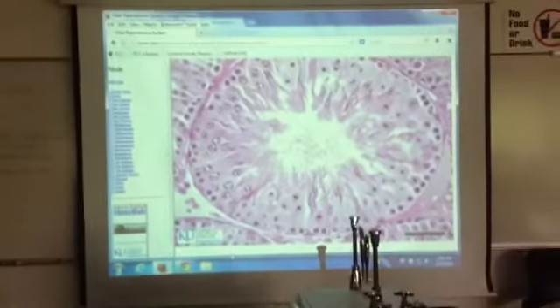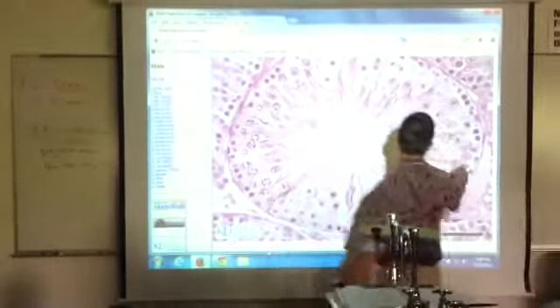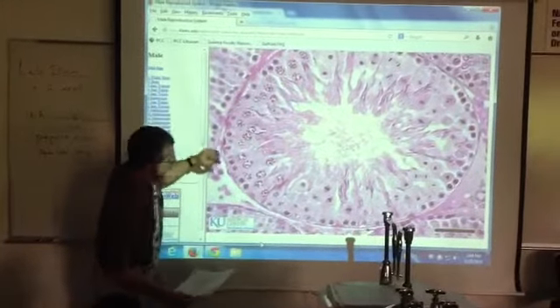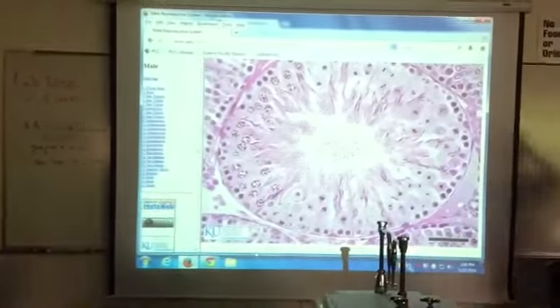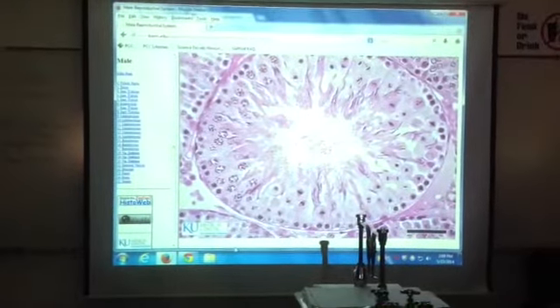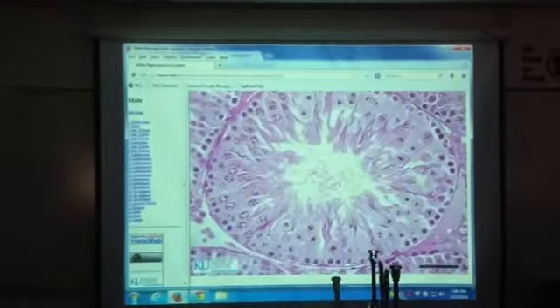Can I ask a quick question about that slide? Sure. So, was there an obvious sustentacular? Max, or Josh, can you let those shades down, please? That one. Thanks. I'm going to go with those two. Sustentacular, Sertoli, sustentacular, Sertoli. Okay, there's those two. They just look odd. Usually they're pointy and triangular. Thanks.